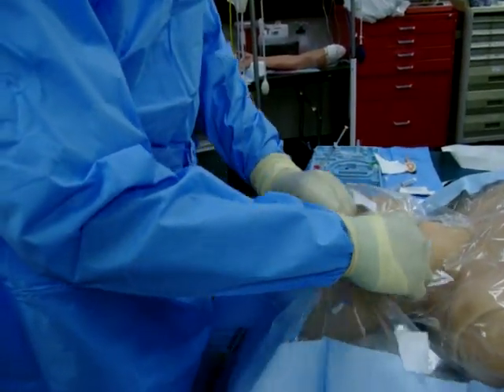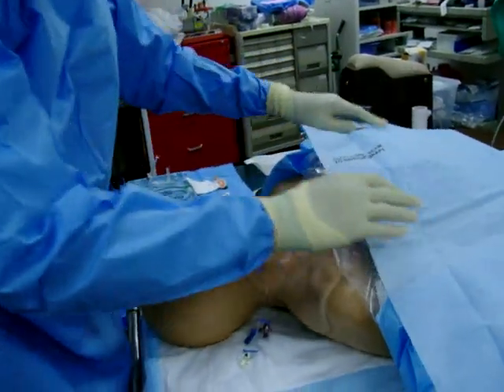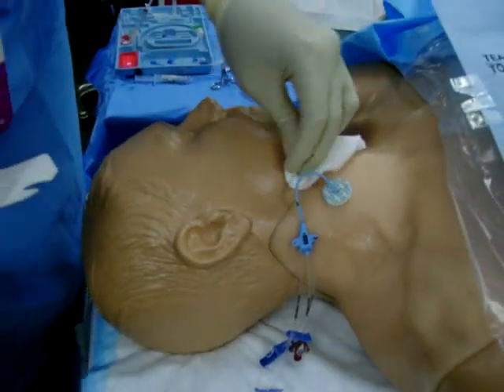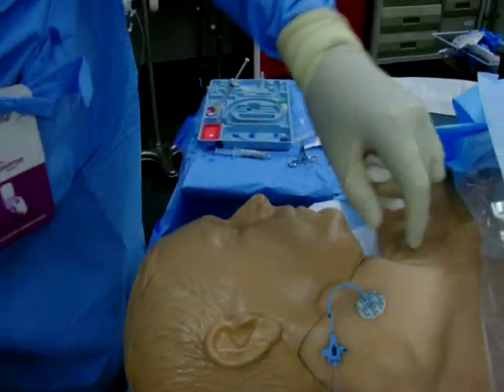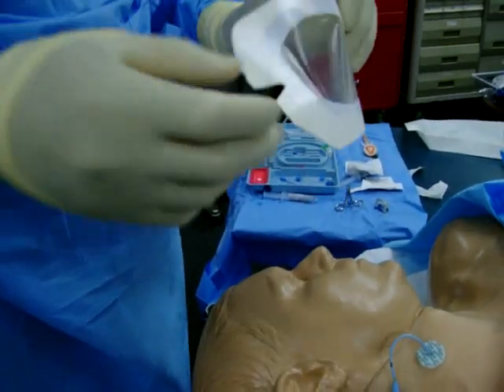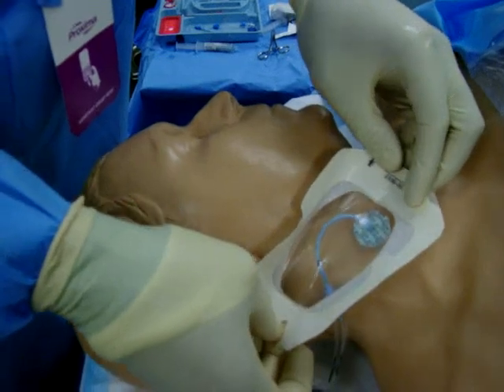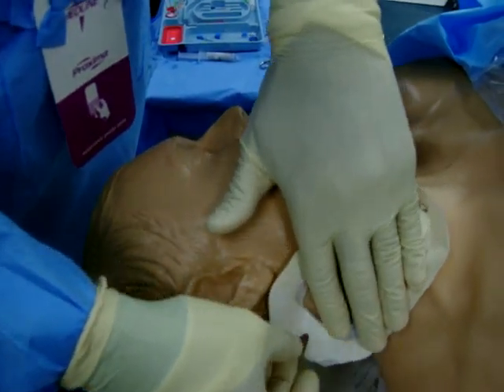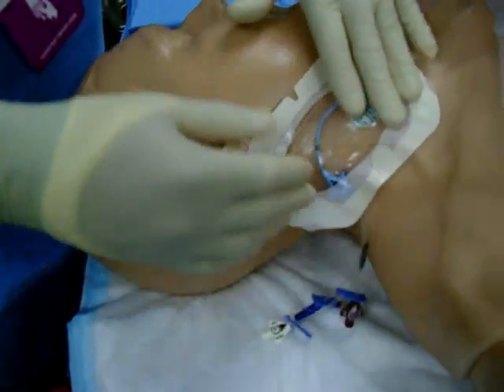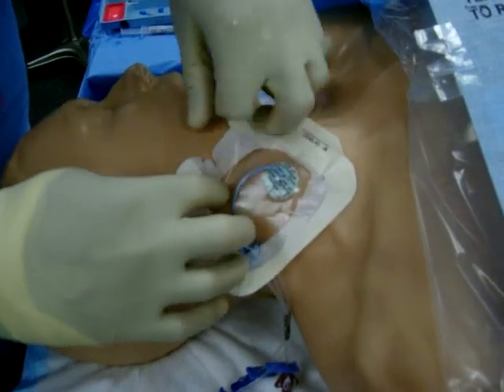The easiest way to apply the tegaderm is to lift the drape up over the patient here. The patient is relieved that you're done. Grab your tegaderm and some gauze. Make sure you dry up the area well because you can't stick tape to something that's wet — and again, this line would be in a little bit further. Place your tegaderm over it. I always like to fold it with the crease of the neck and kind of follow the contours of the catheter in, making it a little bit more comfortable for the patient. Try to leave the ports out — it is poor form if you have them hanging up by the patient's ear. Then go ahead and peel the rest of your tegaderm off.